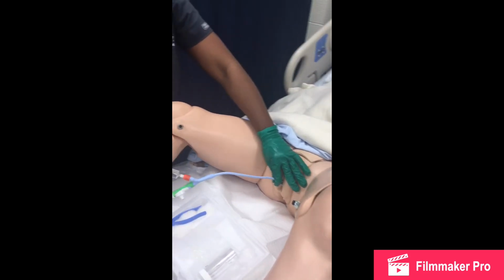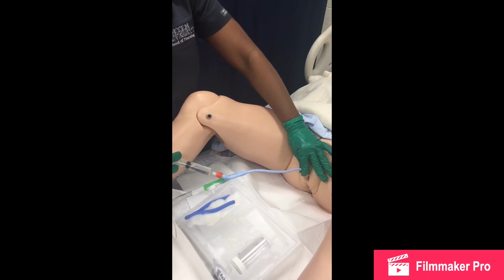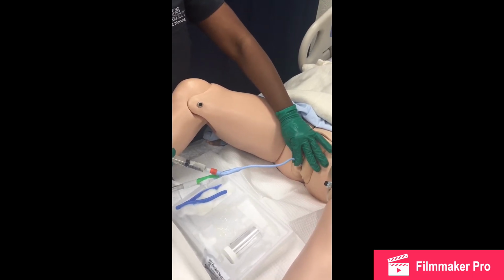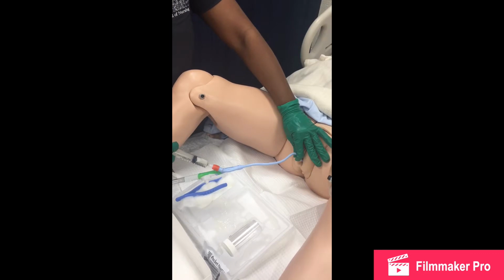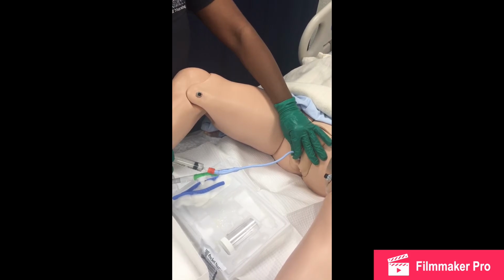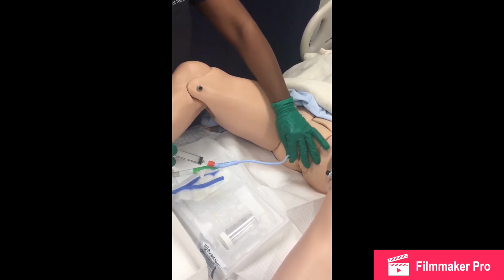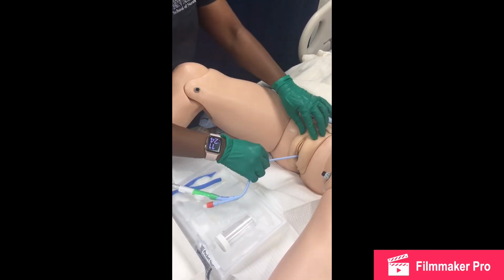I'm going to put the 10 milliliters into the Foley catheter to inflate the balloon. And I'm going to unhook my syringe, and then I'm going to pull back until I meet some resistance. Alright. At this time, I can take off my sterile gloves.